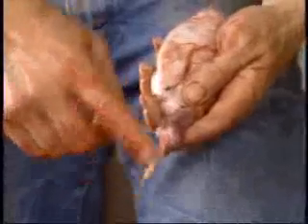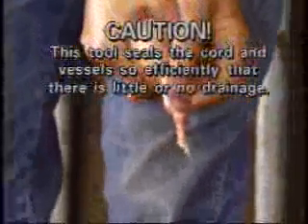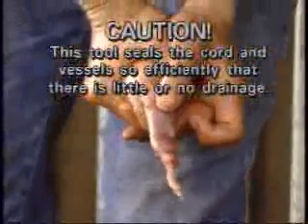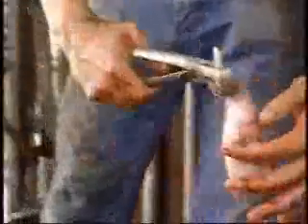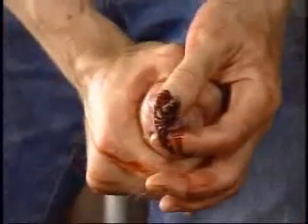Little, if any, blood can be squeezed from the testicle through the twisted portion of the cord, and the same condition exists at the end of the cord where the testicle was removed. By contrast, note what happens when the cord is compressed with a typical emasculator. This can be demonstrated by cutting away the twisted portion of the cord, then applying the emasculator to the cord of a severed testicle, squeezing the testicle. It is easy to see that emasculating the cord does not entirely close it.